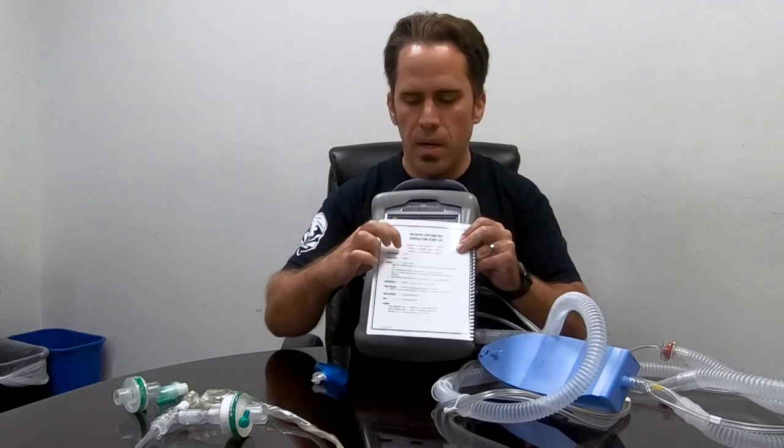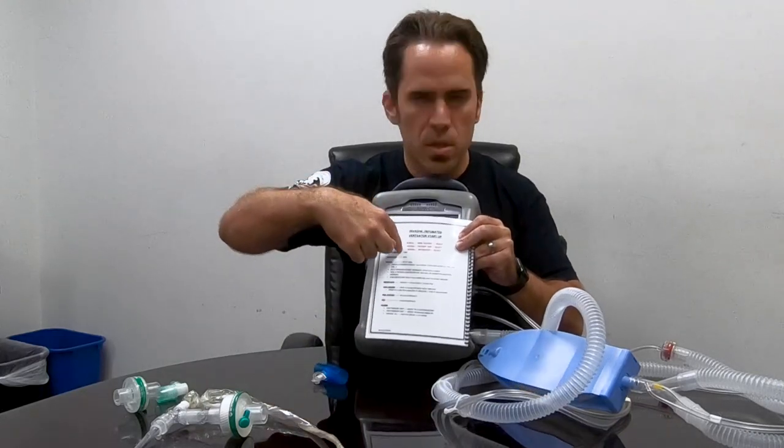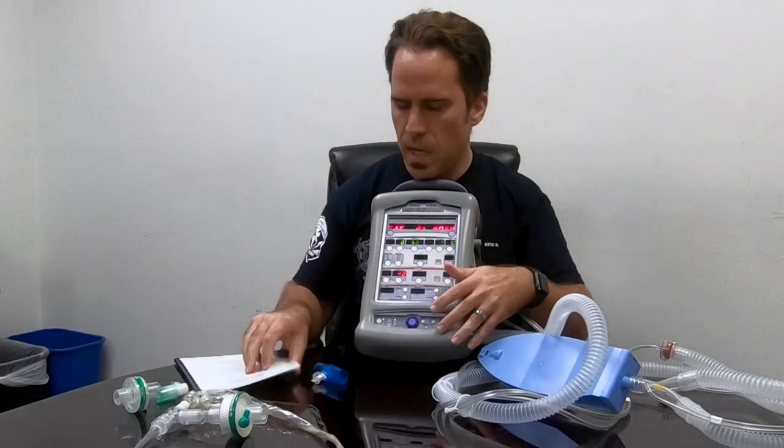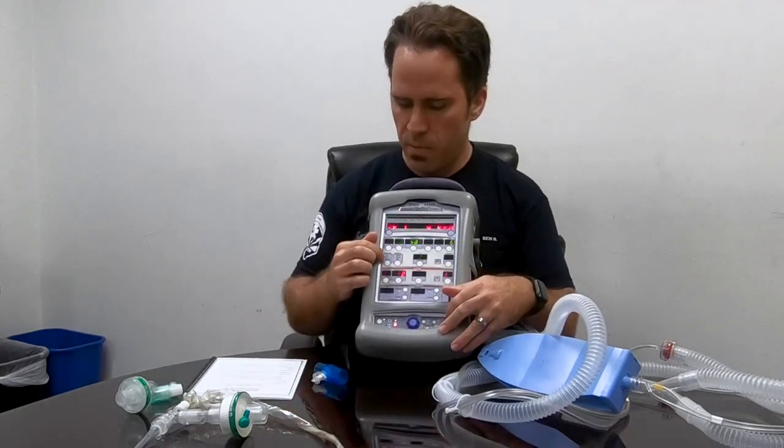If that's as far as we got, this is already better than all of us with a bag valve mask — with a BVM we get a D, but this right now is getting a B. And remember, this is an open book test, so just keep going and you'll get it all the way to an A-plus.